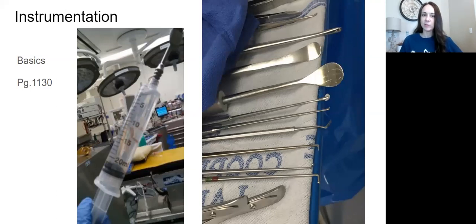So some surgeons actually choose to use the Gigli saw, which is a little crazy to me to use on the head on purpose. But for me, I've seen it when our drill was stuck. So we go to use the drill, it gets stuck, battery stops working. What do we do? We need to get the skull off as quickly as possible. Give me the Gigli saw.